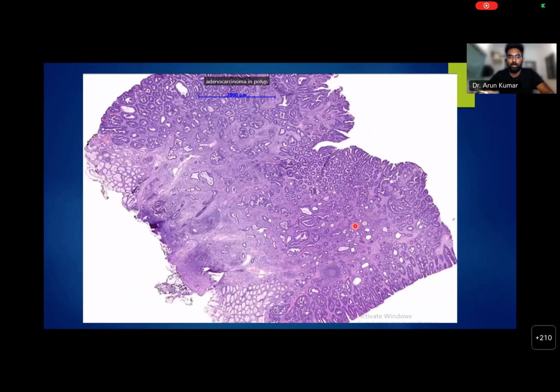One is highly packed dense glands, and the other area is showing some normal architecture. But to comment more, I need to go into higher magnification. Like at this point, I cannot say anything. But yeah, few areas of necrosis can be seen. Correct. So as against these glands, which although compared to normal are obviously distorted and cribriforming, there is some more anarchy happening here.